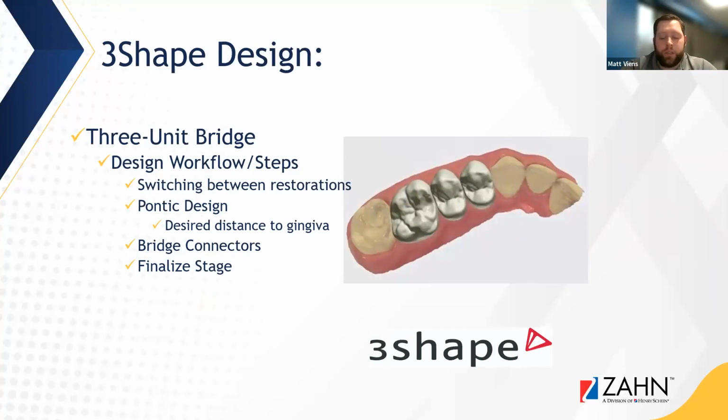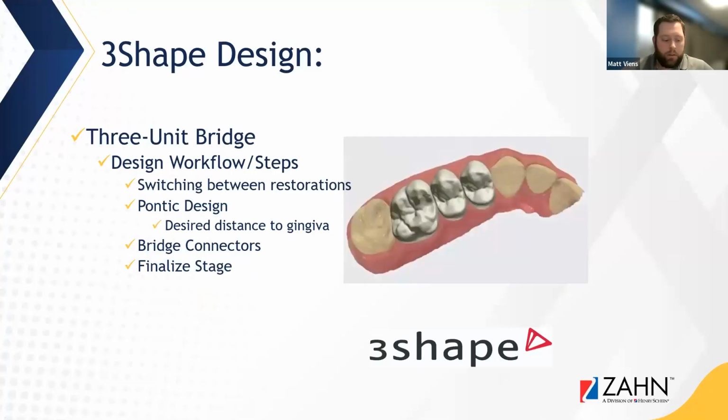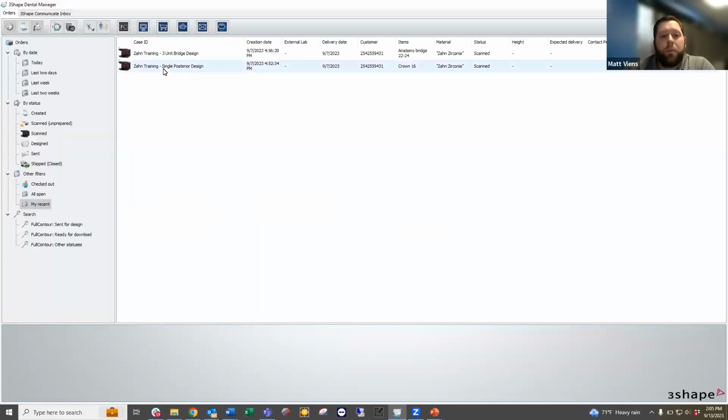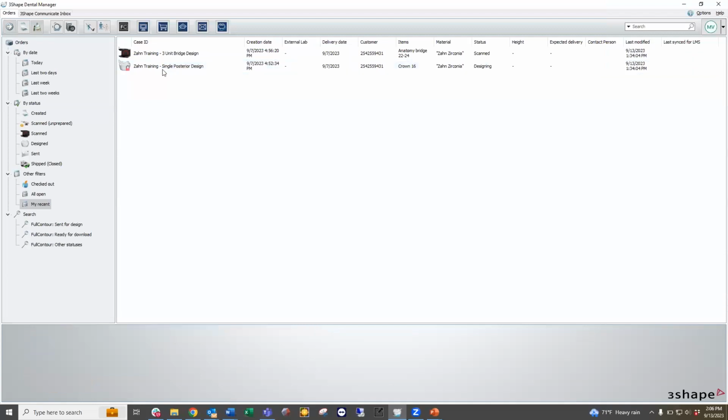So with that said, let's go ahead and dive into 3Shape. We'll open up our first case, which is going to be the single posterior design. On the single posterior design, we're going to first open up the case that has already been scanned for us. So we already have our case annotated and scanned in, so everything is just going through the design process.